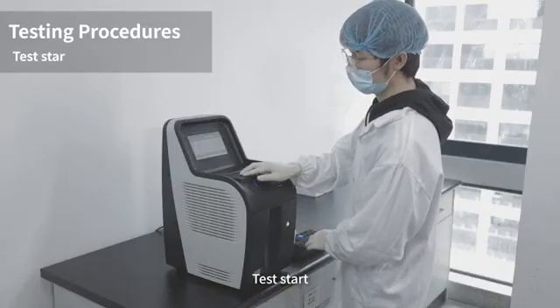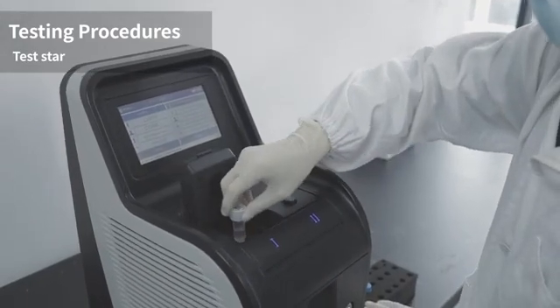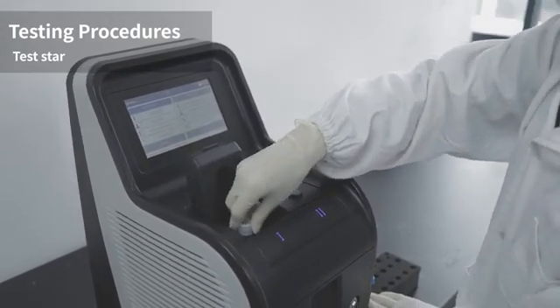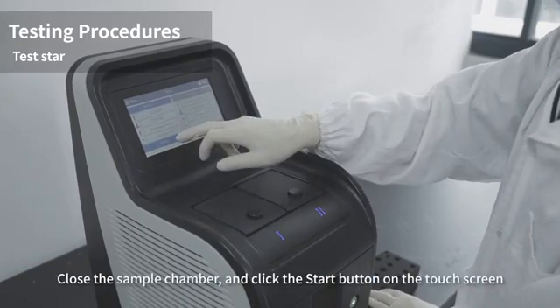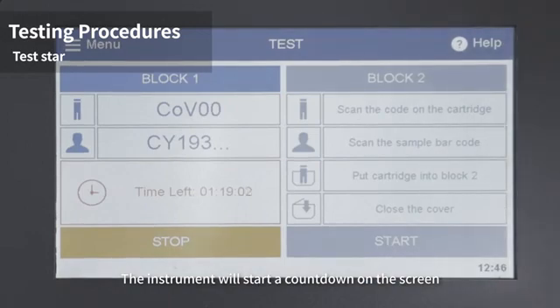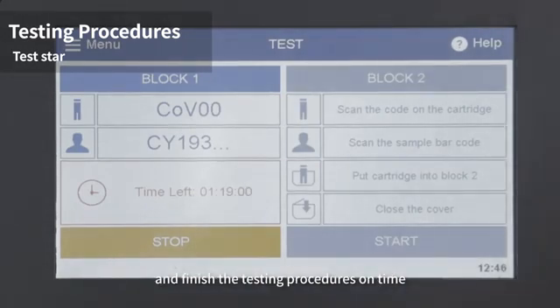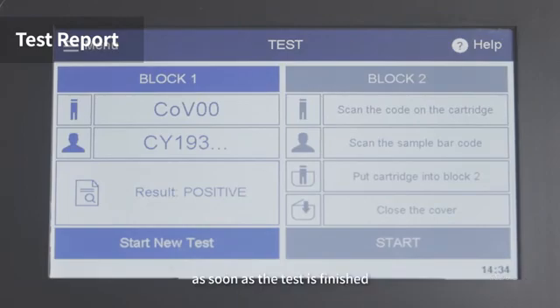To start the test, insert the cartridge into the test chamber of the analyzer. Close the sample chamber and click the start button on the touch screen. The instrument will display a countdown on screen and complete the testing procedures. Test report results will be displayed on the screen and automatically saved in the analyzer as soon as the test is finished.